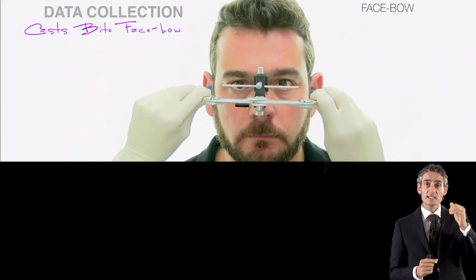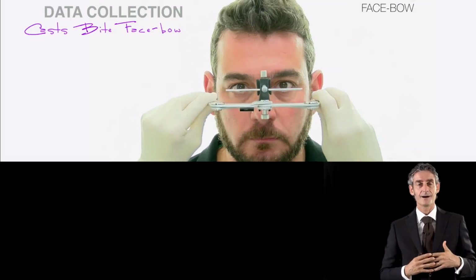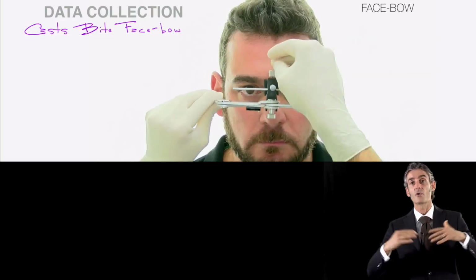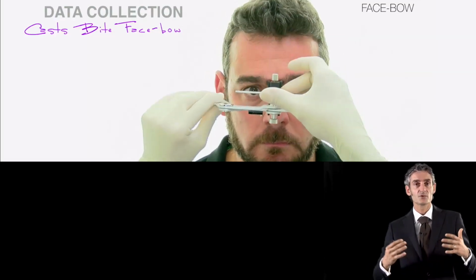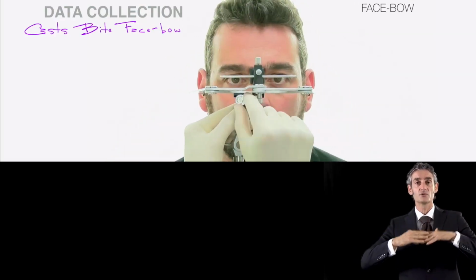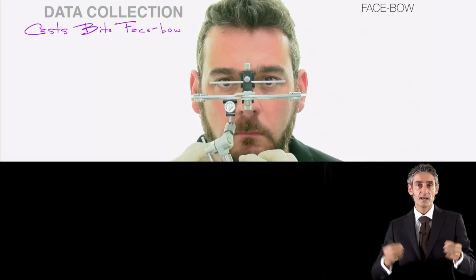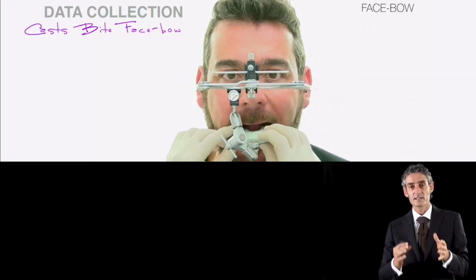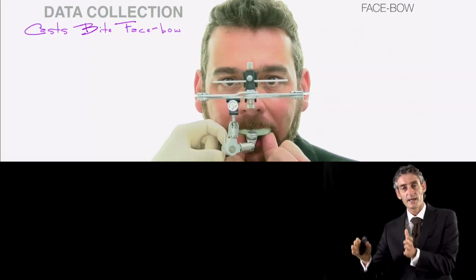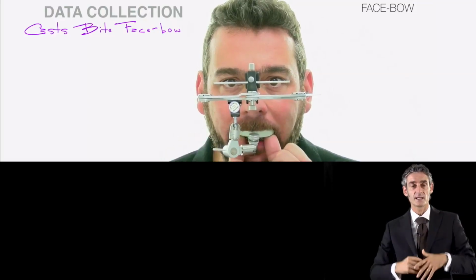Then what do we miss? We miss, for example, the Facebow. So if we want to locate the upper arch in the traditional path in the right position according to the horizon, what we have to do is to take the Facebow. We have to know that the Facebow, the horizontal branch, must be parallel to the horizon that we decided for the patient, and then it's a couple of minutes, and then with this device we are able to transfer the position of the upper arch inside the articulator, and the technician will have an idea about how the upper cast is positioned in the space.